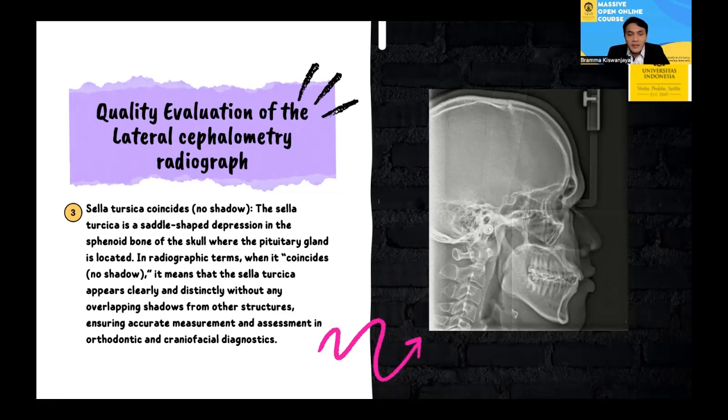In radiographic terms, when it coincides or has no shadow, it means that the sella turcica appears clearly and distinctly without any overlapping shadows from other structures, ensuring accurate measurement and assessment in orthodontic and craniofacial diagnostics.